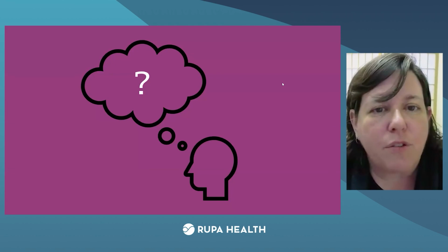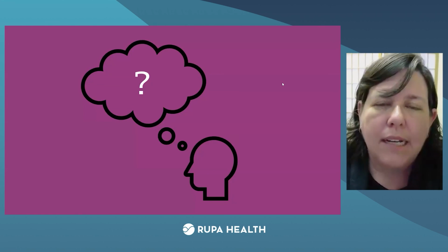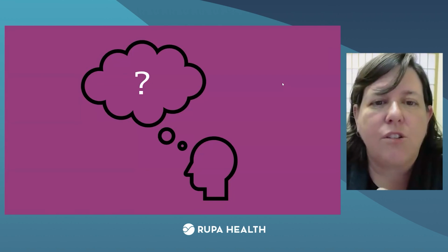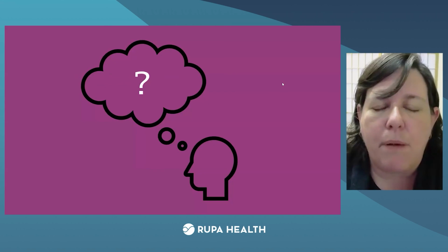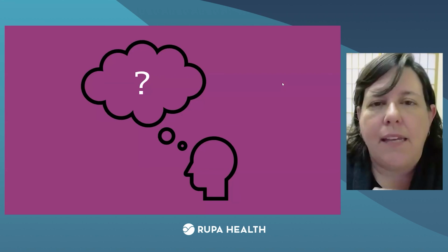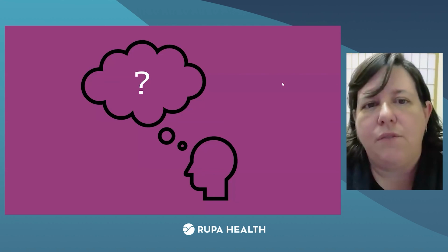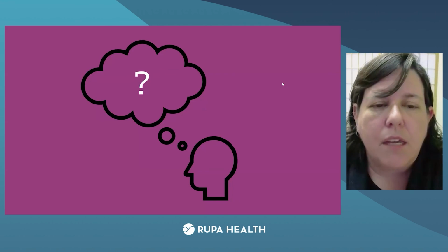Someone who had a TSH of 3.9, but once again, those normal T4s, normal T3s, remember, the TSH tells you how happy the brain is. If the brain's not happy, doesn't matter. The body will keep T4 and T3 normal as long as possible. And you'll see it in the total T4s, but you want their TSH ideally to be within those levels.